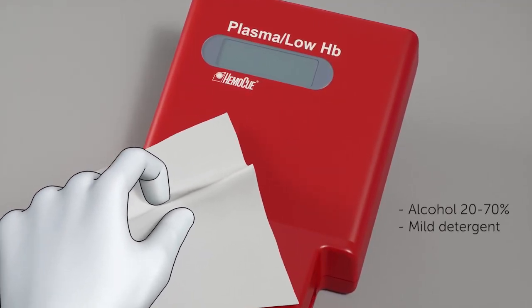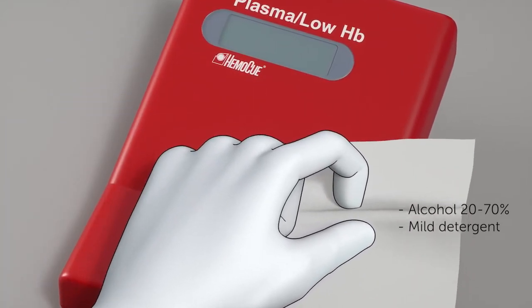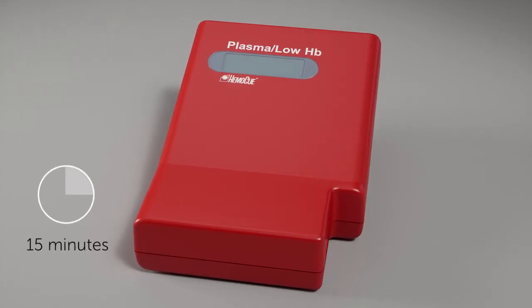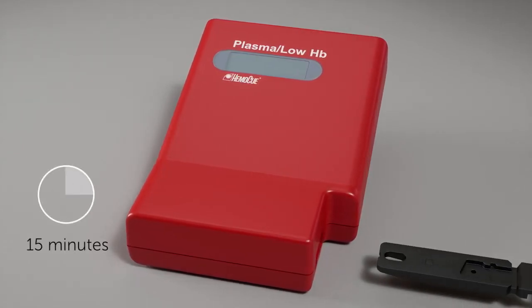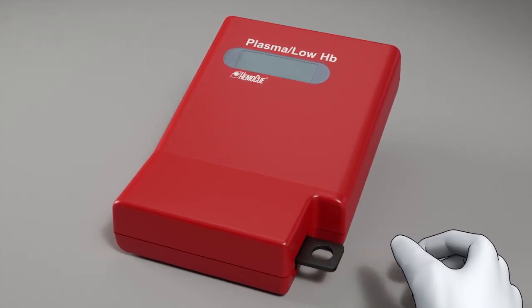Clean the cover with alcohol, 20 to 70 percent, or with mild detergent. To make sure that the cuvette holder is completely dry, wait 15 minutes before placing the cuvette holder in its place. Your photometer is now ready for use.